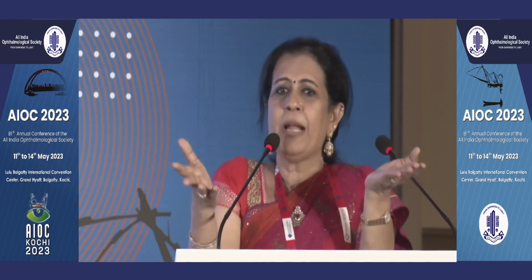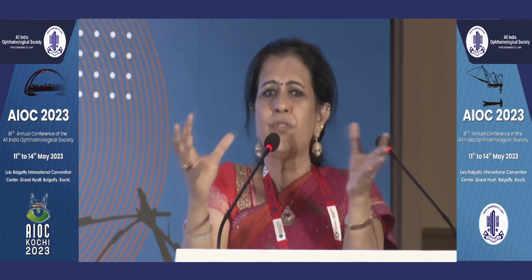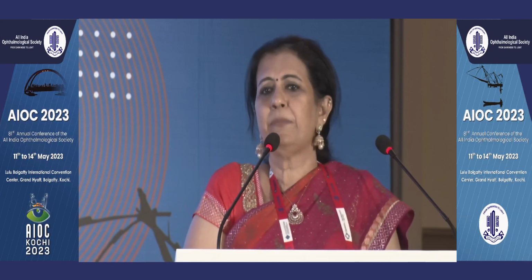So in our practice, what we do is, we definitely give all 3 options to our patients. We even give surface ablation, everything. We explain to them which would be ideal, but we have slowly slipped into doing Contoura for higher astigmatic corrections. For the others, we actually guide the patient and leave it to their choice. They are contemporary good technologies.